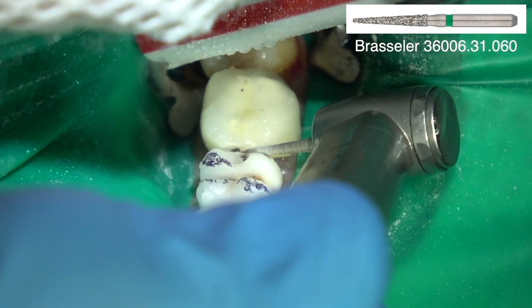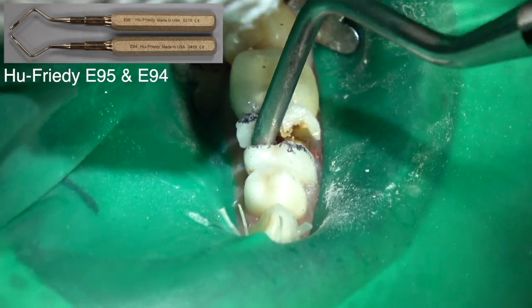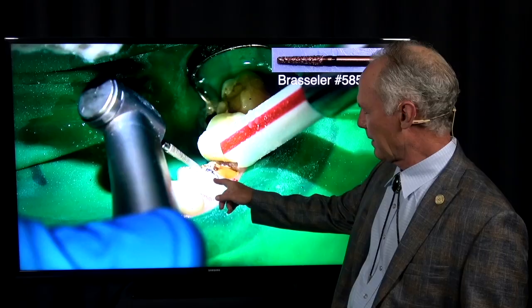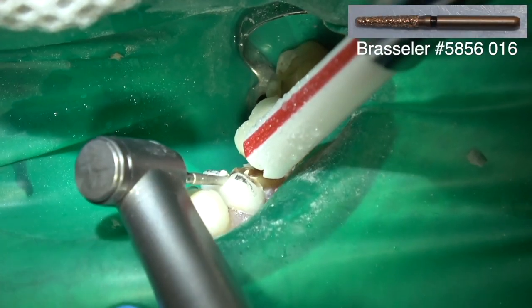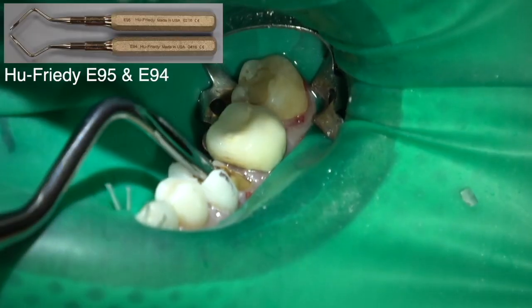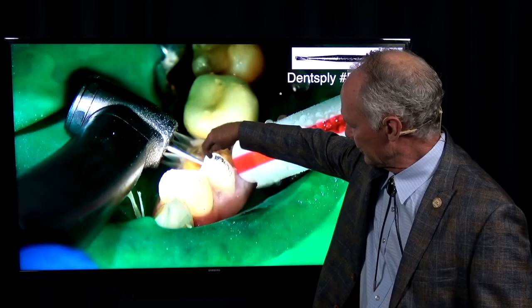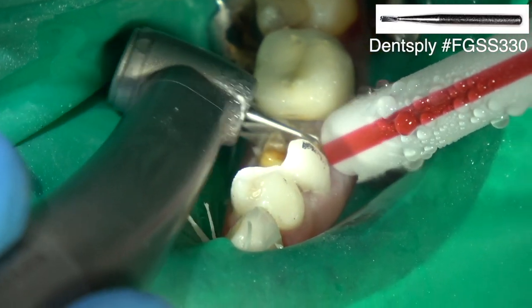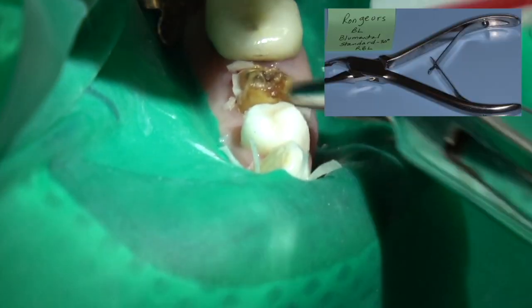I'm cutting here so when I torque that distal piece it's got a place to move into — without space to move the sectioned pieces, you're more likely to fracture a root. So I've cut through the crown. This piece didn't move, so I'm cutting through it mesial to distal and torquing it. Now I'm taking a 330 carbide and making a little cut underneath the crown, then putting an elevator in that spot and just torquing it up to remove that last piece.